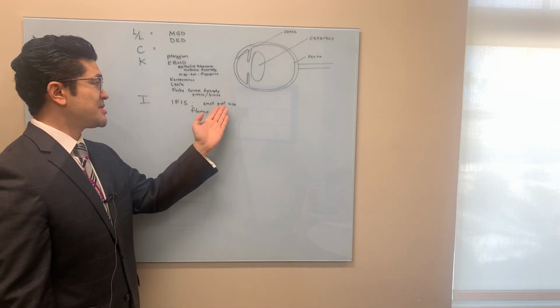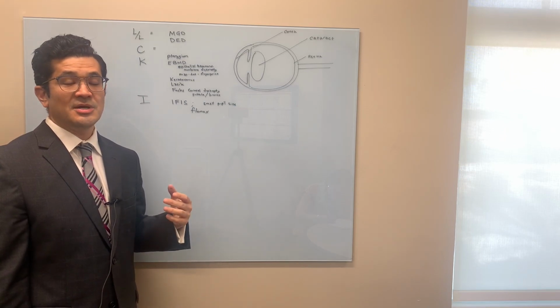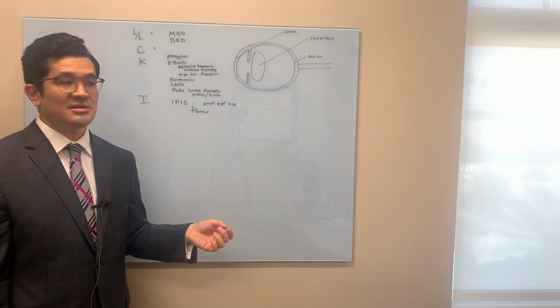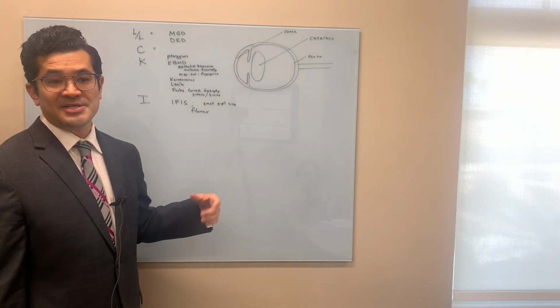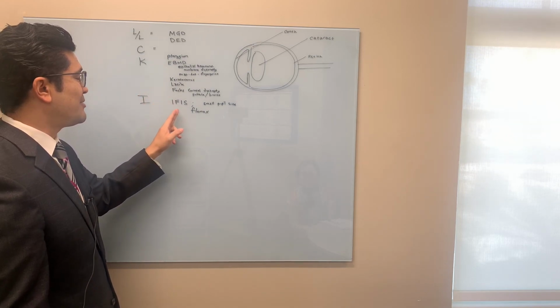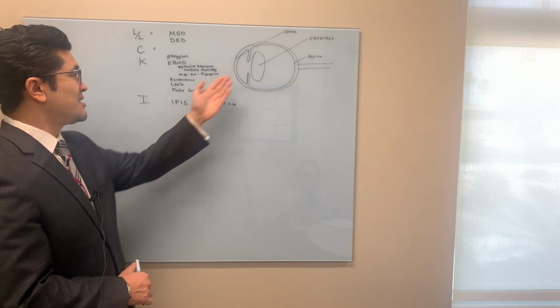So in these cases with a small pupil, it matters in our surgical planning, because now we're going to make sure we have iris retraction devices on standby, whether it's a Malyugin ring, a Visitec ring, or iris hooks. We can often stabilize the iris with our new technology during surgery. So this matters in our surgical planning. How well do they dilate? We always want to use good dilation for the patients for a cataract evaluation.